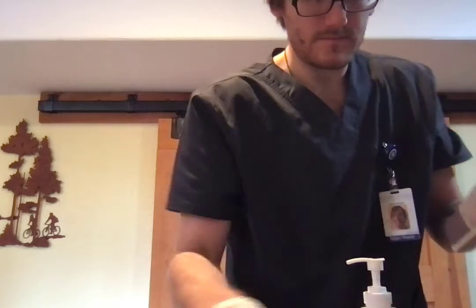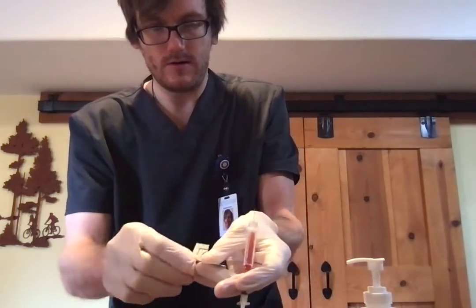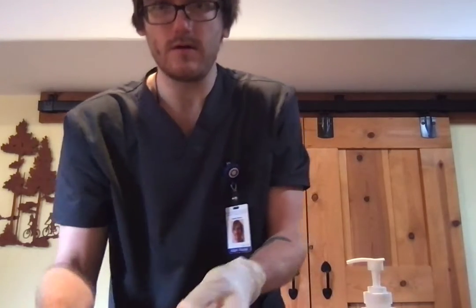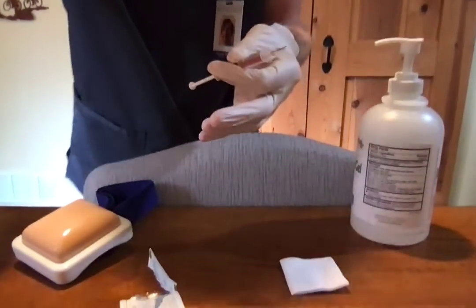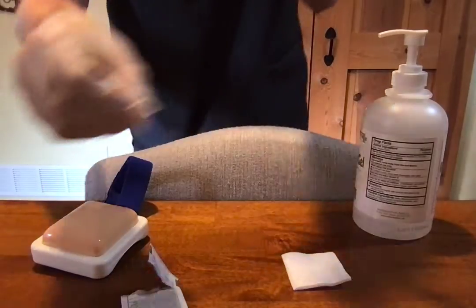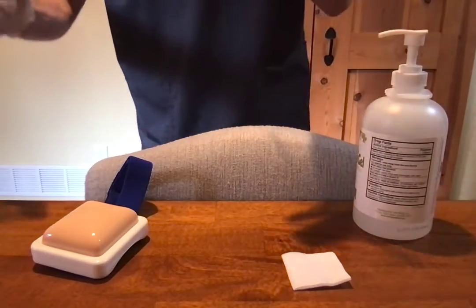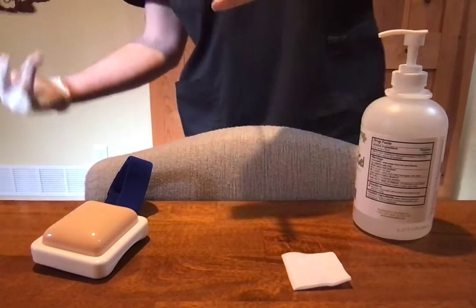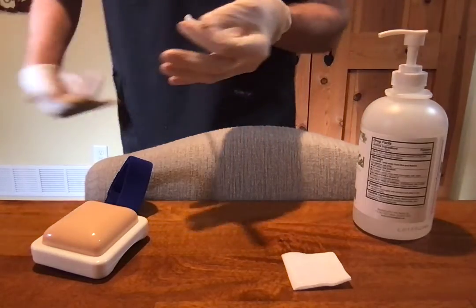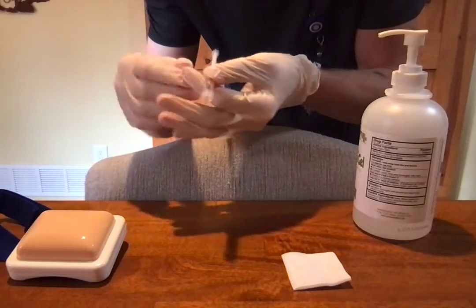And then I'll come to my patient and I'll sanitize them. I'm just going to make sure that you guys actually can see it this time. Now it's going to be just my verbalization, since it's not on an actual model this time around, but like I was saying, this could be in either the back of the arm or the abdominal area. In this case, we're going to just pretend that this is right here. So I've used the alcohol on them.